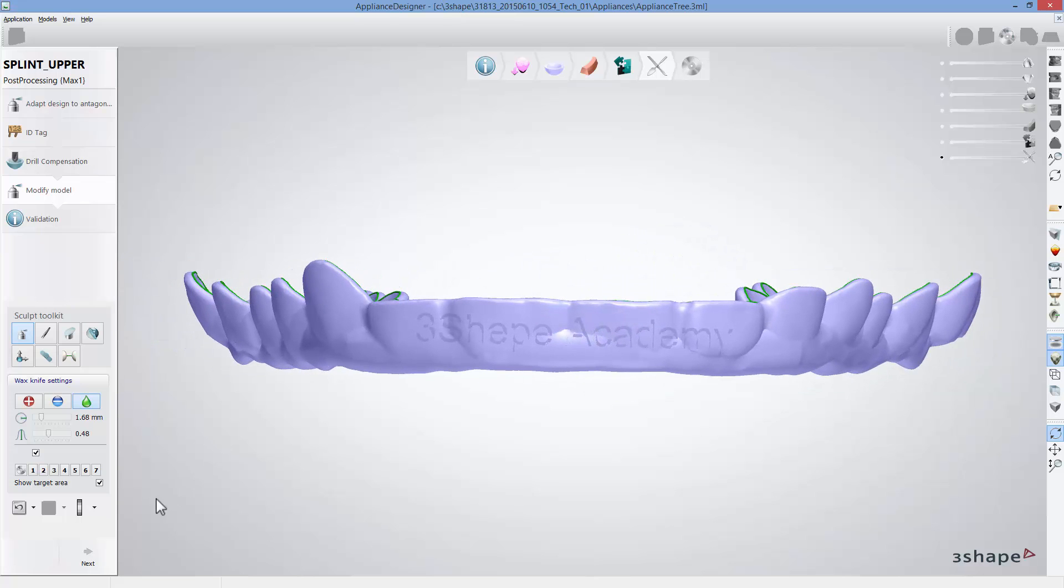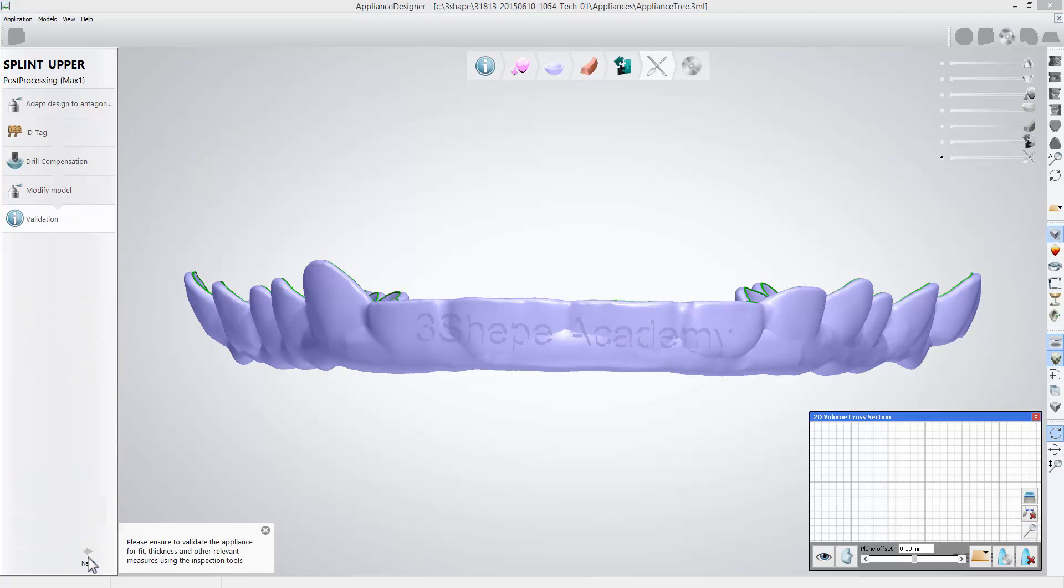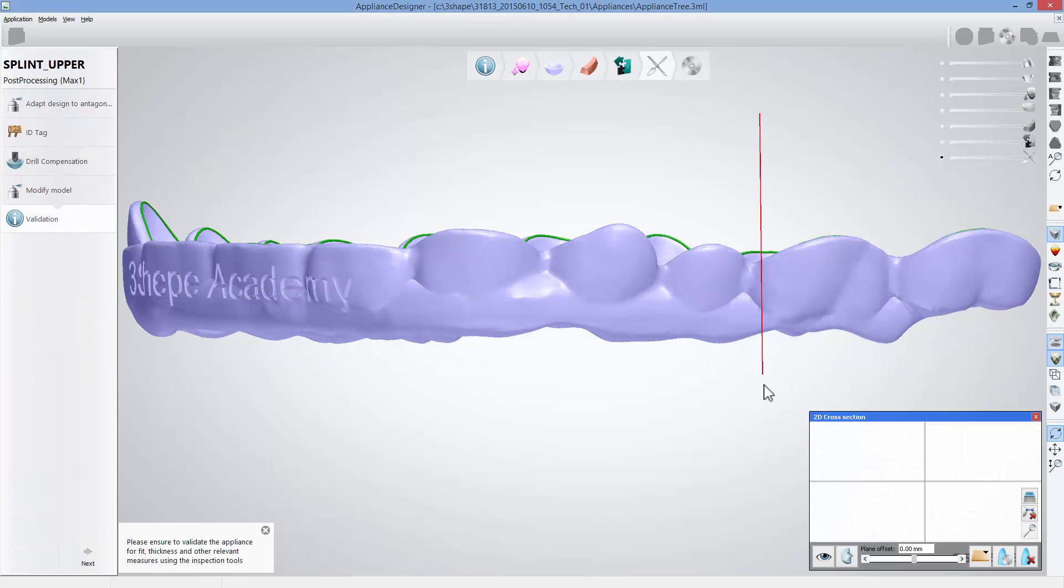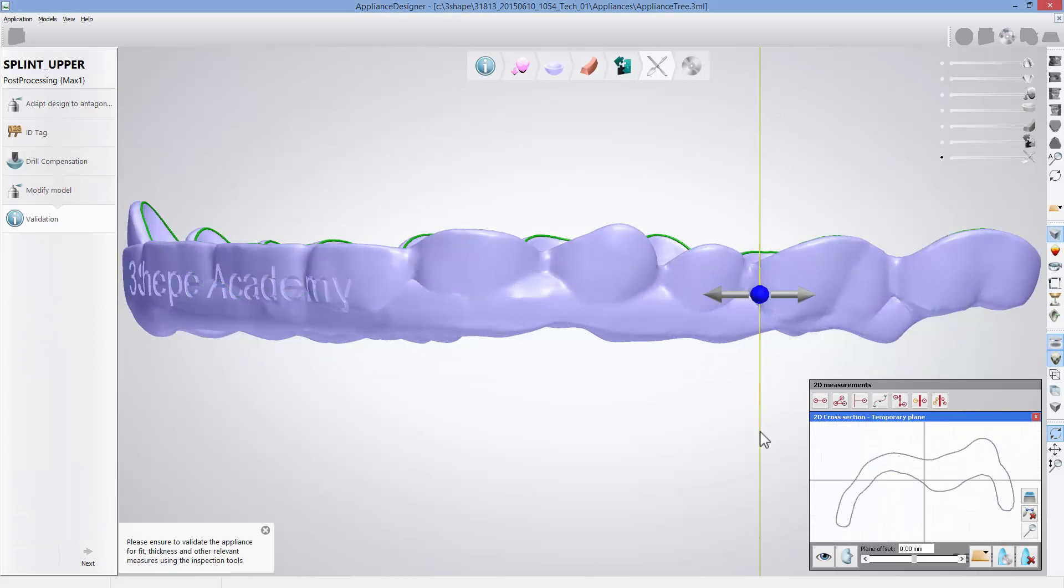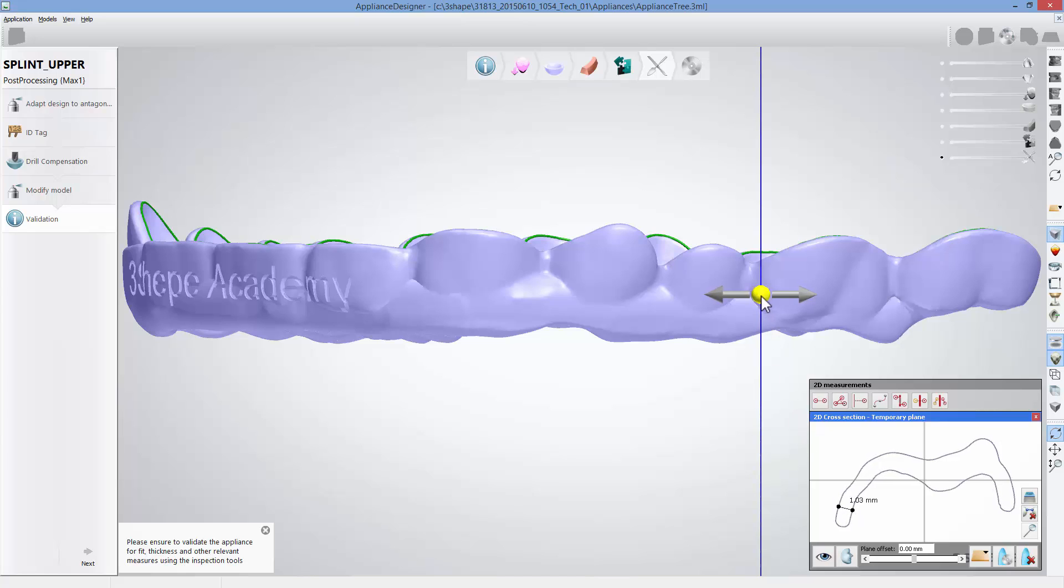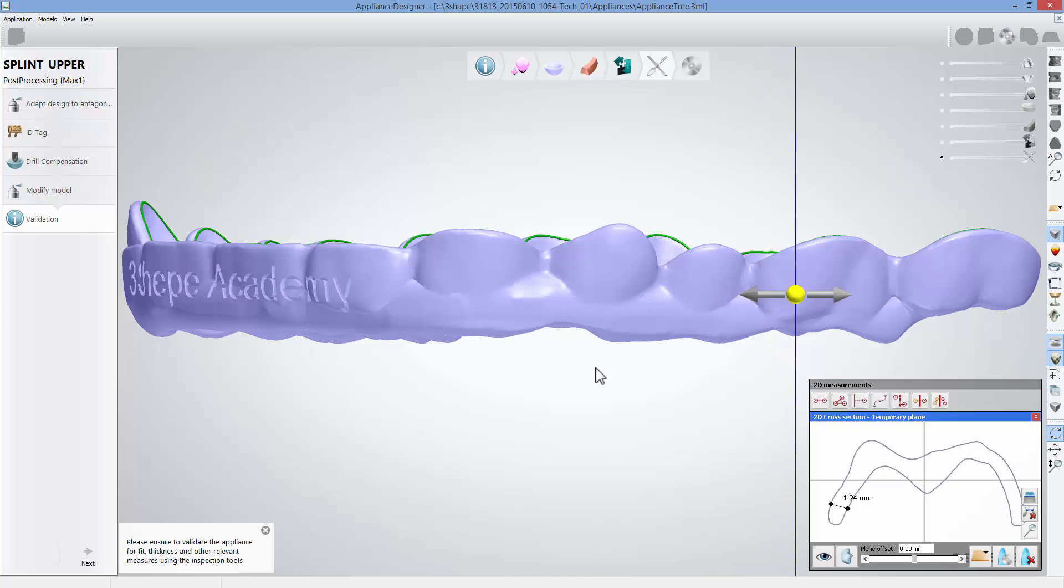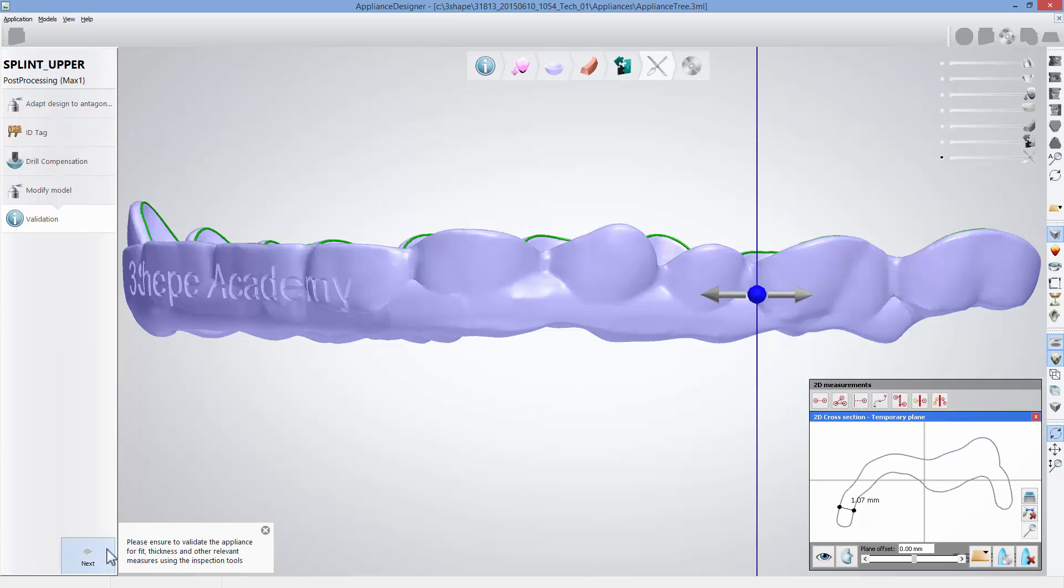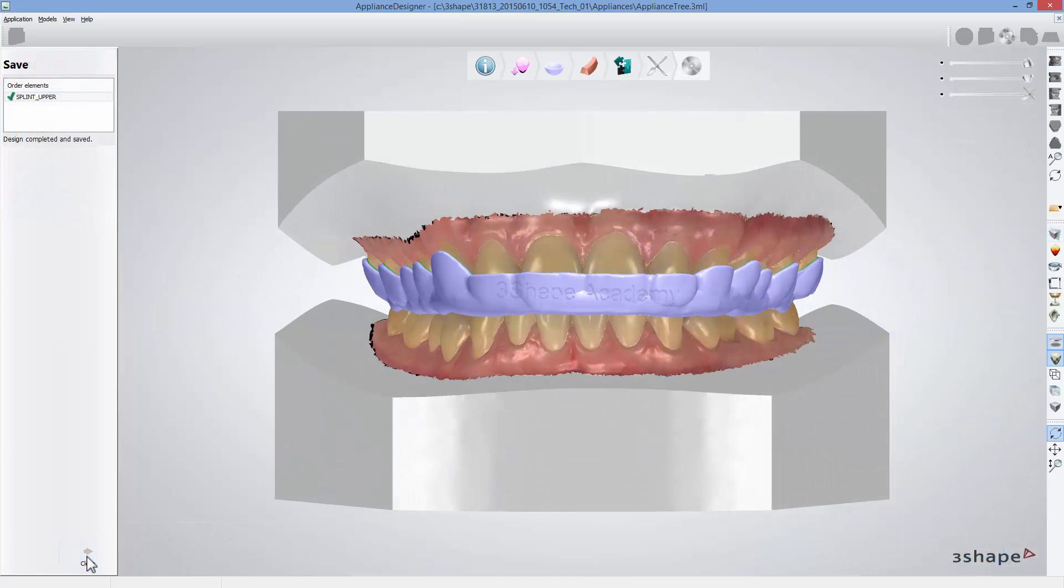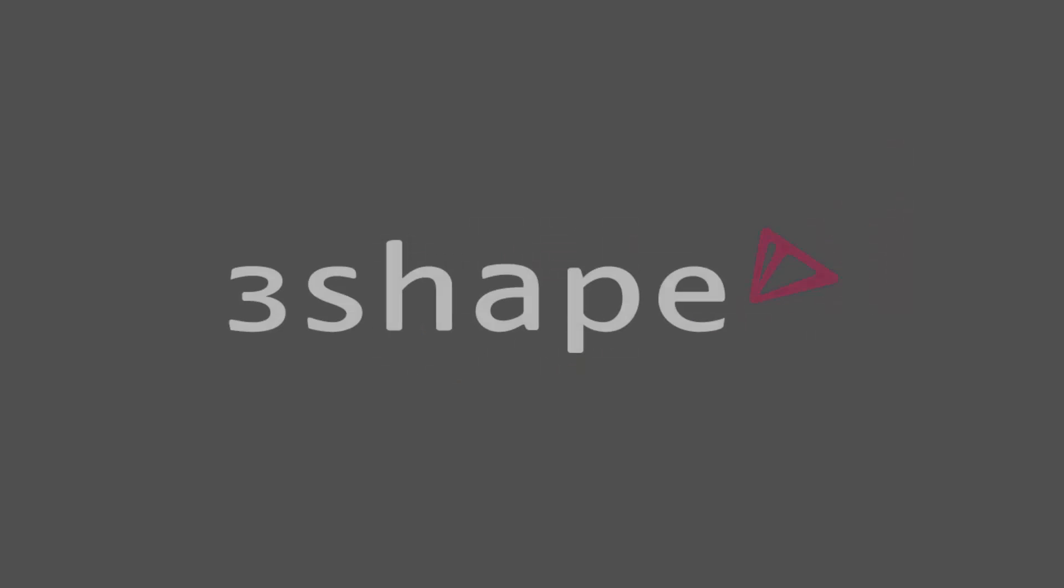When done, click next to move to the validation step and use 2D cross section to check if there is enough material thickness for the splint to be produced. After validating your design and making sure that everything is alright, click next to get to the save step. Then click close.